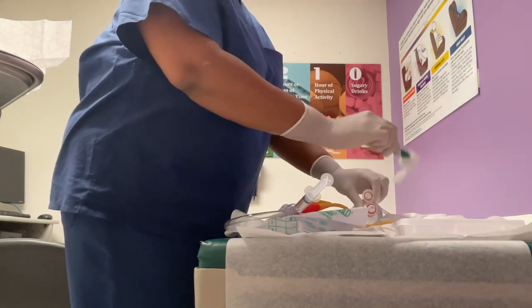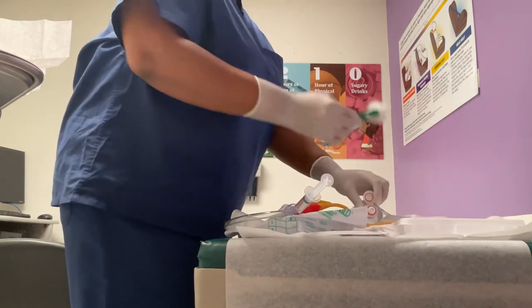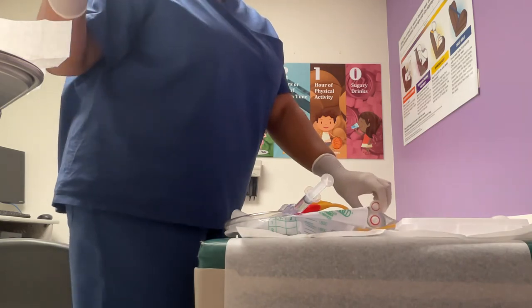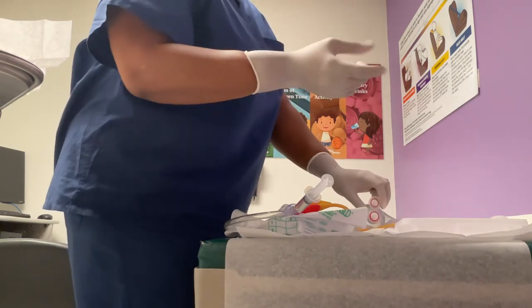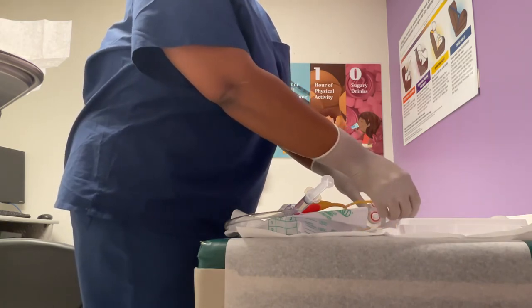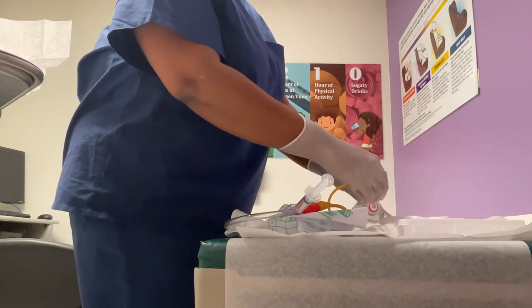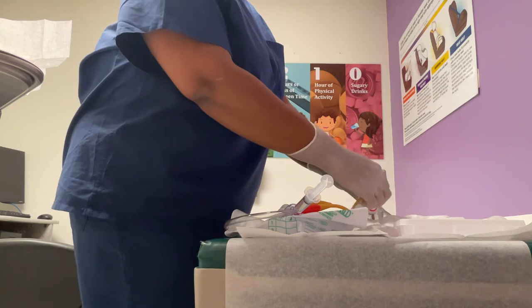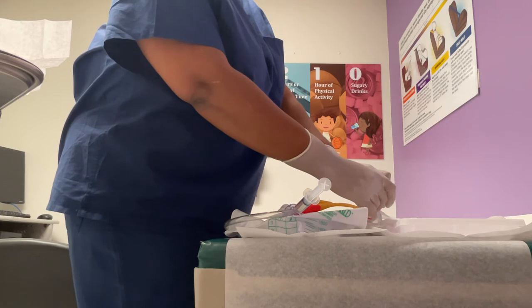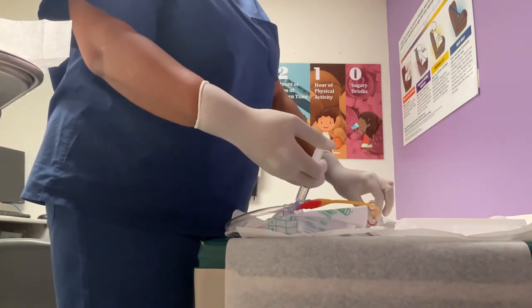We're going to wipe the other labia and toss. Then we're going to go down the middle in one last stroke. We're going to drop the cotton balls and clamp in the box. We're going to take our lubricated catheter, hold it two to three inches, and insert it until we see urine. I see urine — so I'm going to hold the catheter, then inflate the balloon.